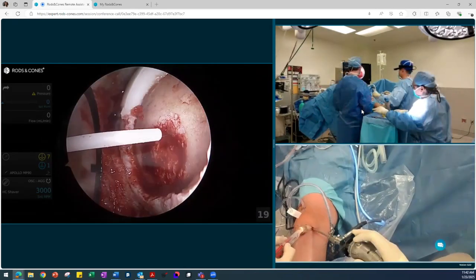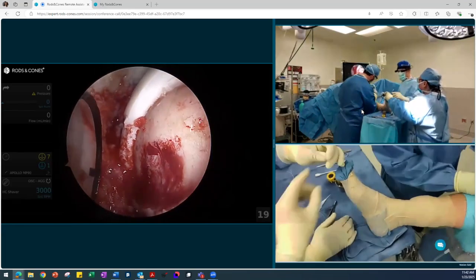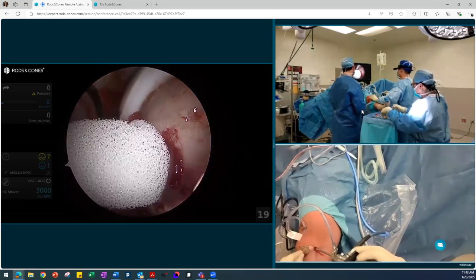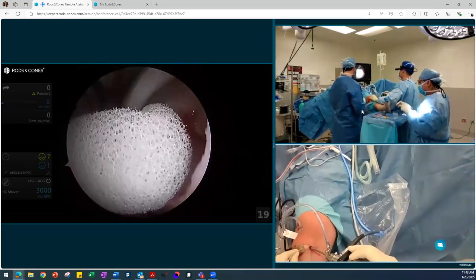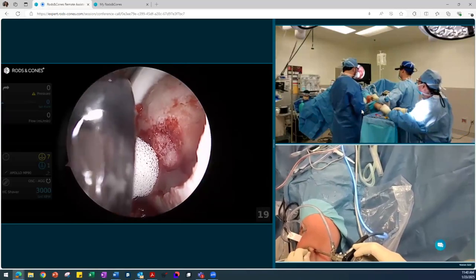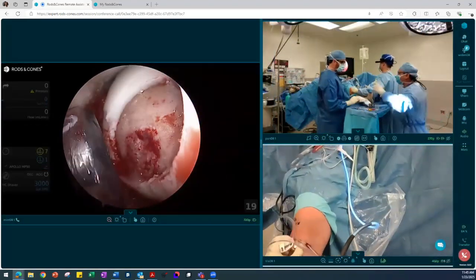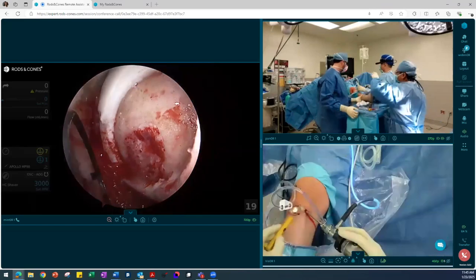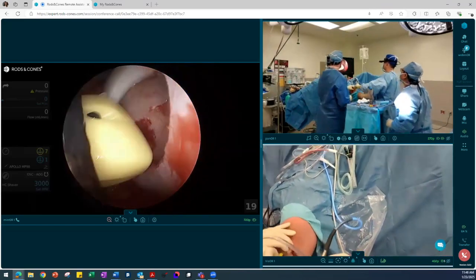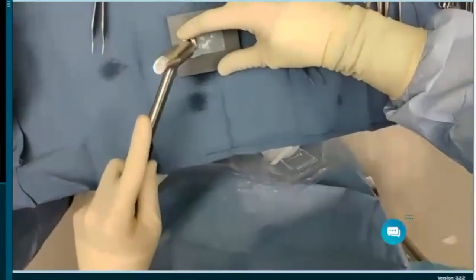If there's still bleeding, you're going to see here we're going to do Tisseel, and then similar to what we do in an open procedure, we're going to use the fingertip of these gauze, and you can see we're pressing the Tisseel into the defect to try to reduce the bleeding. This essentially is going to clog these capillaries with this Tisseel. Following this, we're going to use the V shuttle to get our trajectory, essentially a dry run, and then we're going to turn our attention to prepping the MACI.